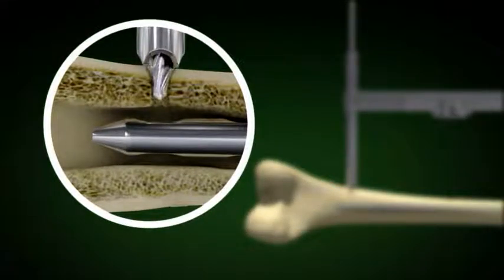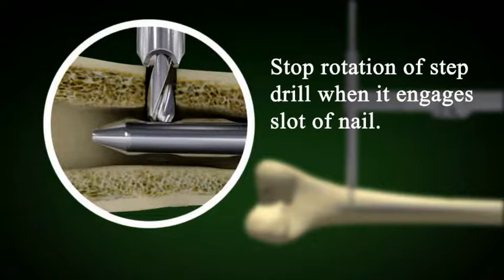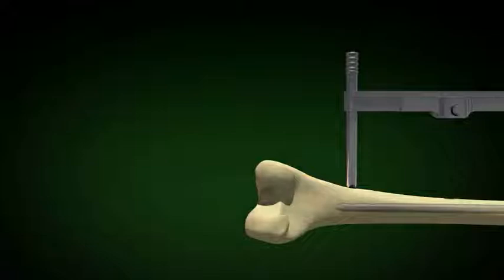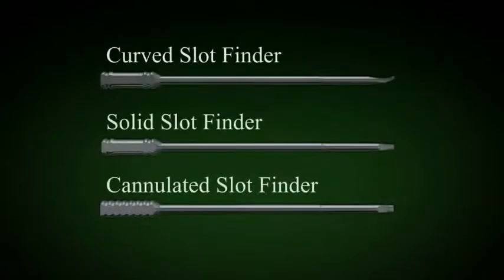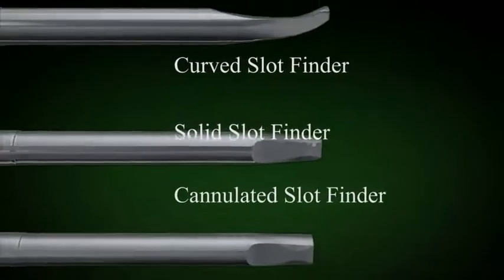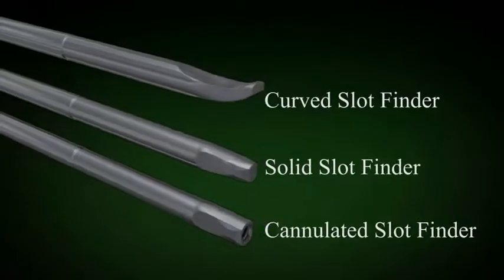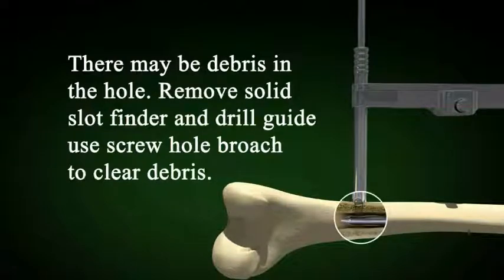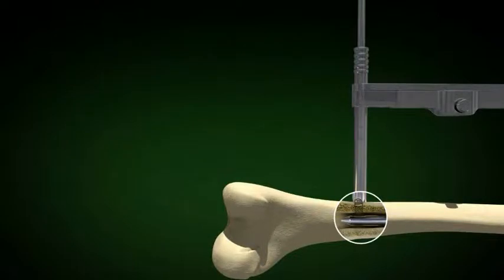It is important to follow the pilot hole or it will not proceed, and when the step drill engages the slot in the nail, stop, because you will make the step drill dull if you continue to twist. We have 3 slot finders: the curved, the solid, and the cannulated, and each has a specific use. Sometimes after drilling the hole and using the step drill, there's debris in the hole of the cortex. This is removed using the screw hole broach.